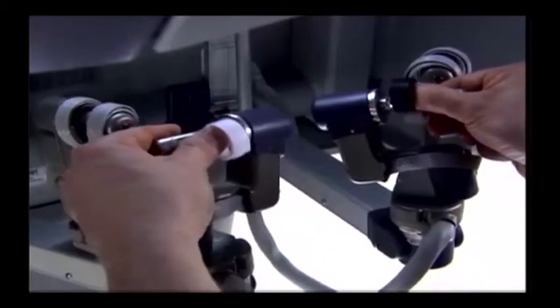And that's why it's so fun, because it's like a game. It's fun. No, I'm just joking, but these finger movements are what works the robot next to the patient.